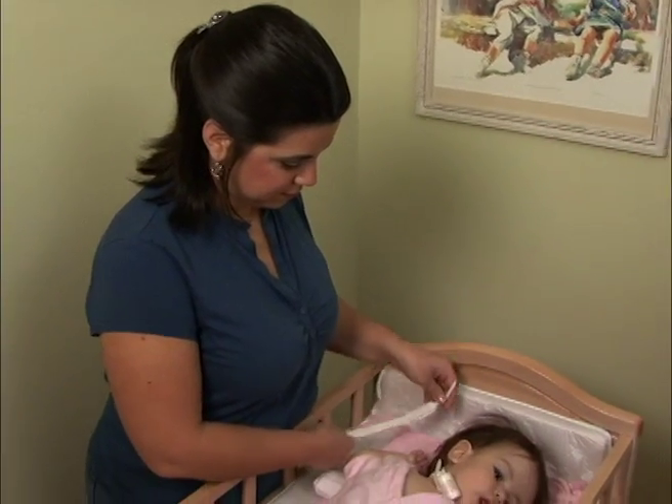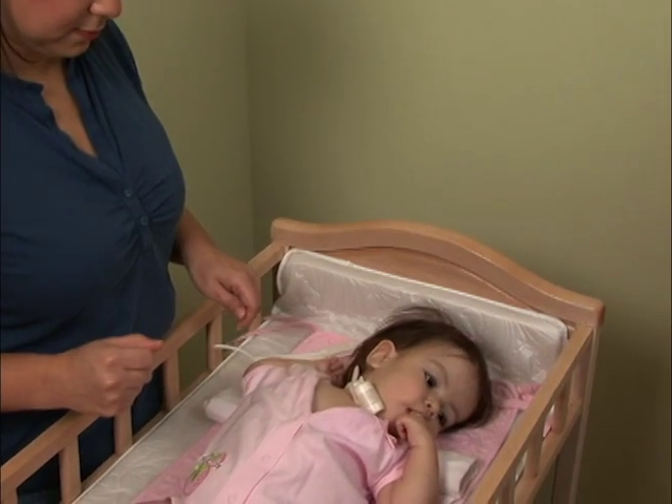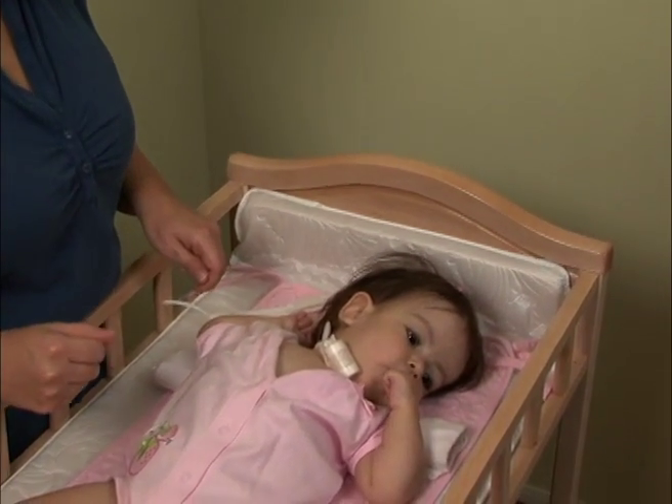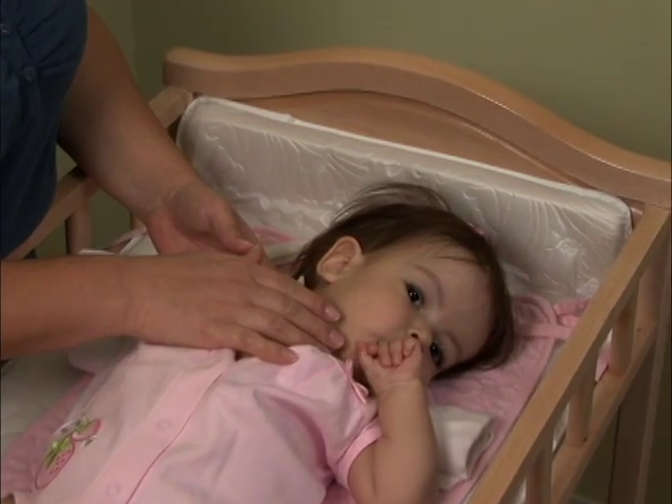Now that your trach tie is cut and supplies are ready, it is time to change the trach tie. One of the most important things to keep your hand and eye on during the trach tie process is the trach itself, so that it does not get a chance to slip out.